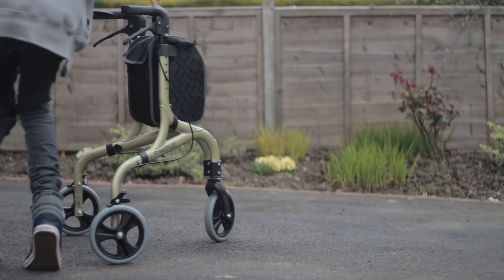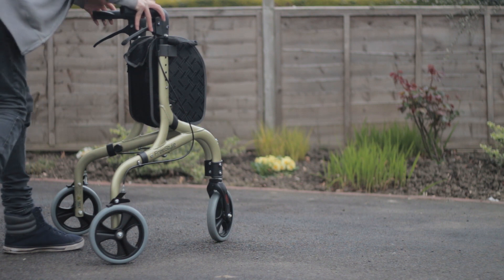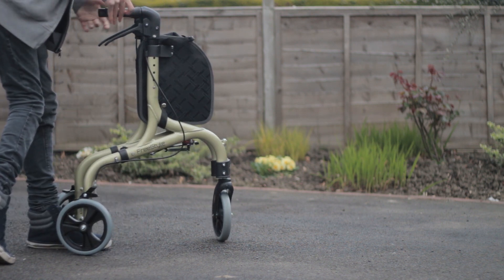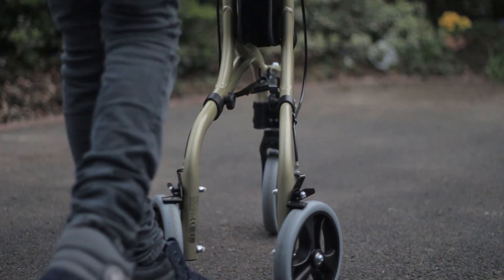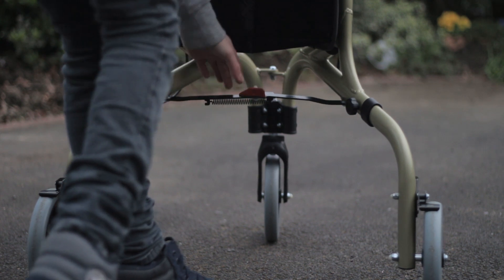The 3 Star Rollator folds easily and compactly, making it fit in small spaces for storage and making it great for travel. When it is unfolded it locks back into place and can be used safely again.